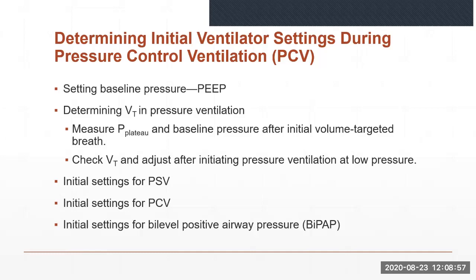It is probably easier and just as effective to set the initial PSV equal to the trans-airway pressure, or the estimation of PIP minus plateau, after establishing these values with volume control CMV. The level of PSV can be adjusted once it has been initiated to an adequate level. Sometimes simply asking the patient if he or she feels it is easy to breathe and if he or she is getting enough air helps in adjusting initial PSV. Appropriate adjustment of PSV level can be done at the bedside.